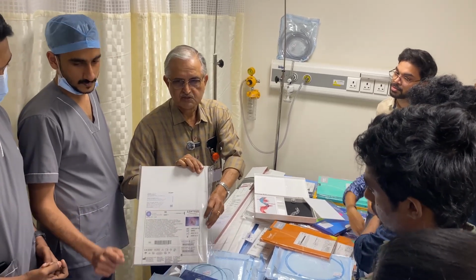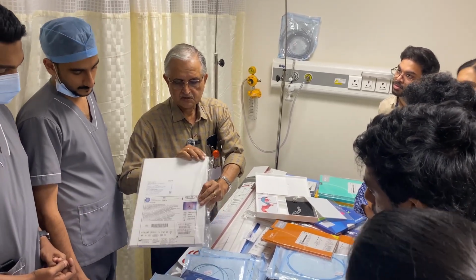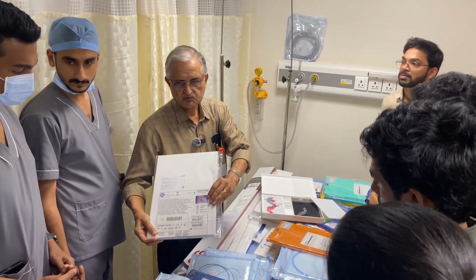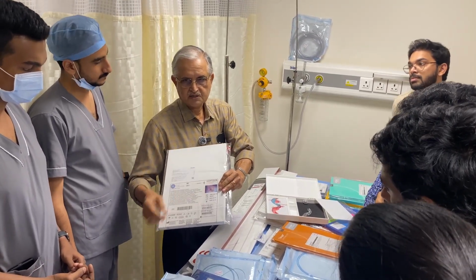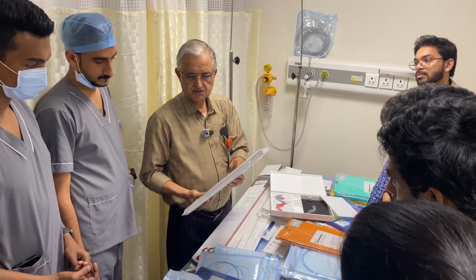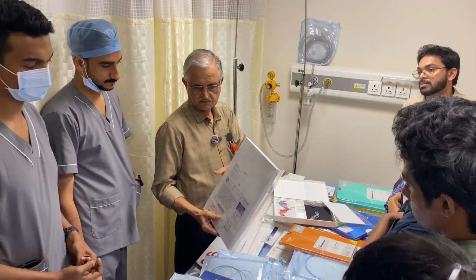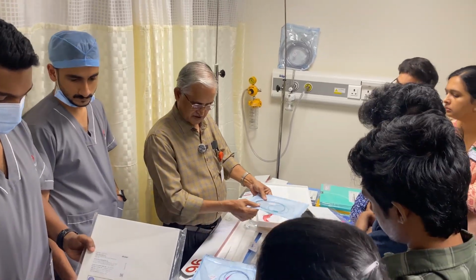Individually, you don't have to put coil one by one. Depending on the aneurysm size and shape, you decide on the plug device, and then you can deploy it there. So this also, I think you need a narrow neck. Very wide neck, you cannot put this. And these are the micro catheters.